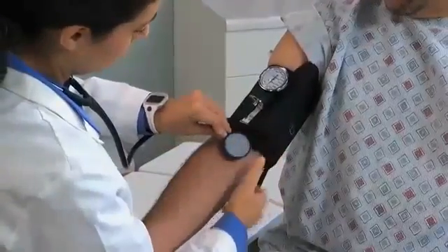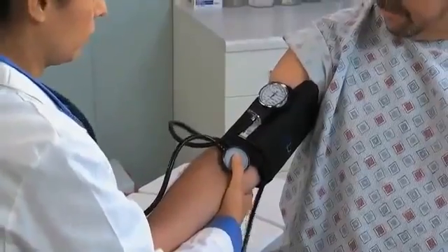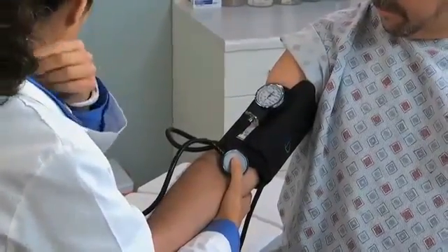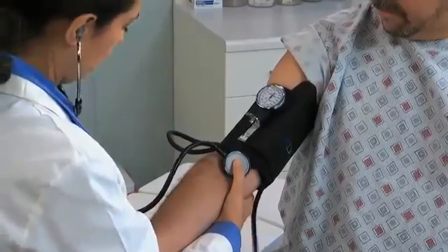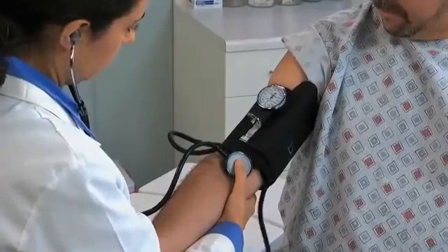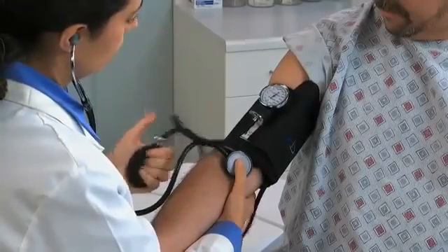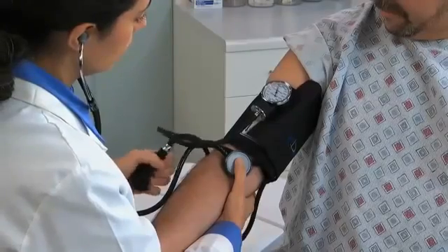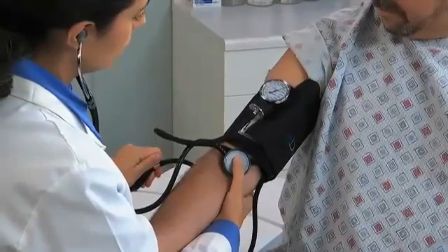Now place the bell of a stethoscope lightly over the brachial artery, taking care to make an air seal with its full rim. Because the sounds to be heard, that is, the Korotkov sounds, are relatively low in pitch, they are generally heard better with the bell. Inflate the cuff rapidly again to the level just determined, and then deflate it slowly at a rate of about 2 to 3 millimeters of mercury per second.